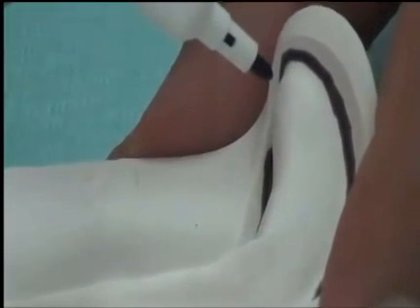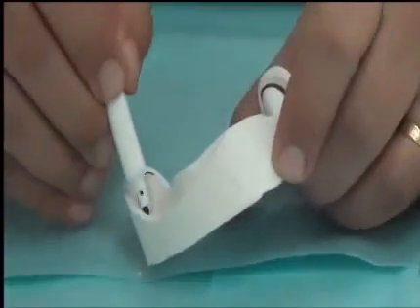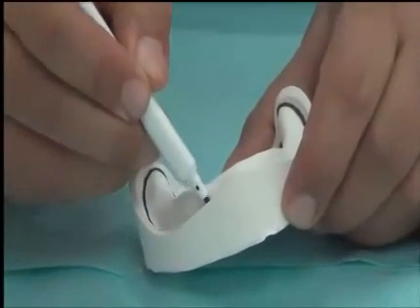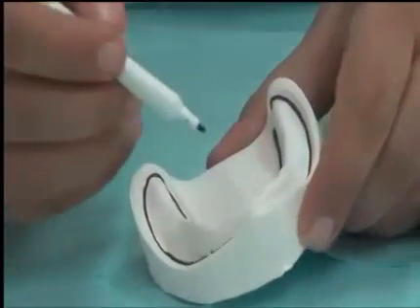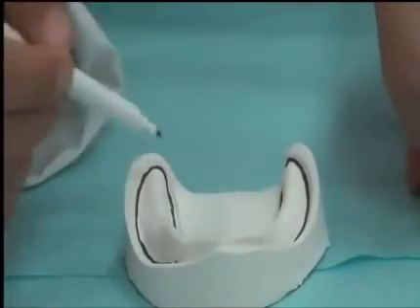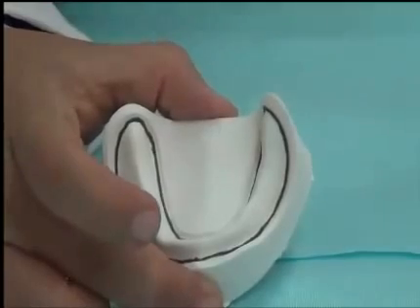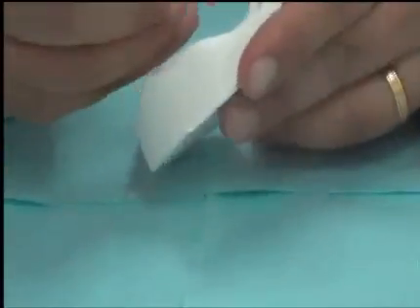But in the denture, not all of the retromolar pad is included in the denture piece. But for the impression purpose, we need to record the whole retromolar pad because we want then to select the areas we need to include inside the denture. So the impression is a bit longer and more distant than the denture borders in the posterior areas. So this is the outline of the sulcus. This is not the outline of the tray. The tray should be 2 millimeters short and away from the tissue.